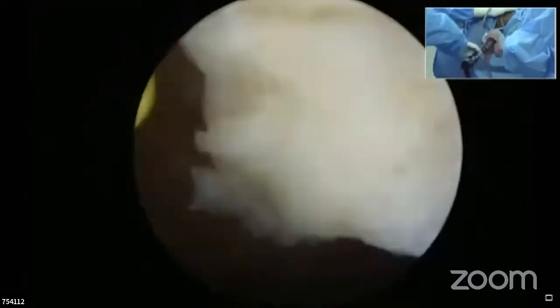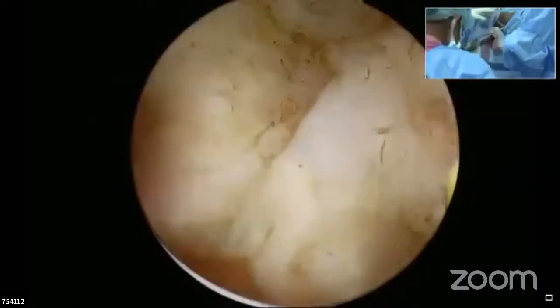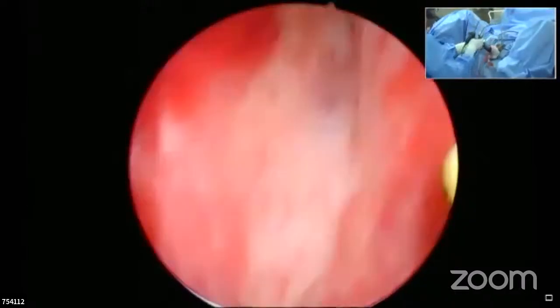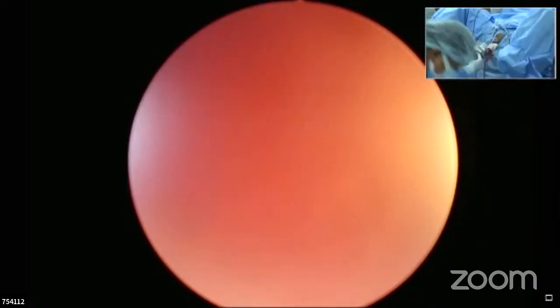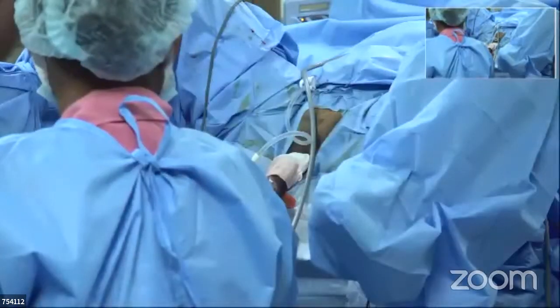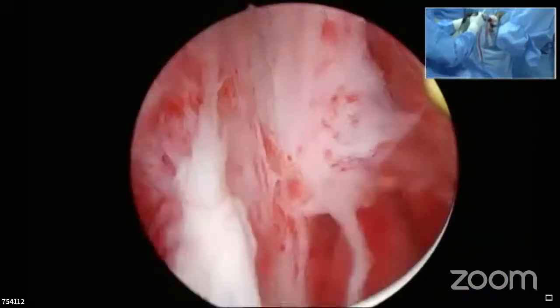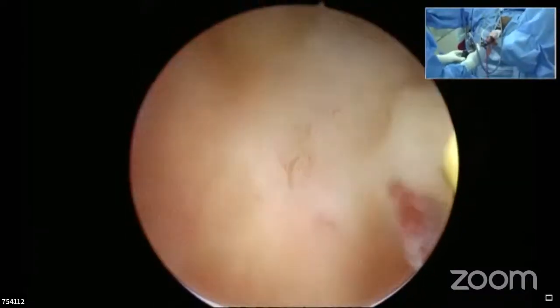Taif, can you talk? Saif, can you show the thing behind from the perimeter? I think he can wash the bladder once. Yes. Two pieces are coming in the prostate. Also, if someone can show the chips in the container, sir, how much has come?